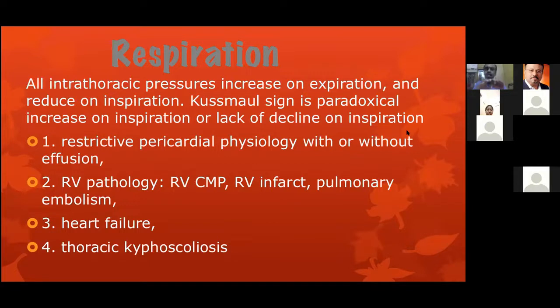So with some of the transducers, if the blood pressure is steeply falling, the mean will also fall along with the blood pressure. Some of them average it for 3 to 4 beats. So what will happen? The true aortic pressure will fall during a catastrophe, but the mean pressure will lag behind. Some of them will take one full page. The majority of ICU transducers are like that. They will take one full page. You will have a pressure transducer till the end, and then the next page will start. Only then will the next page average.